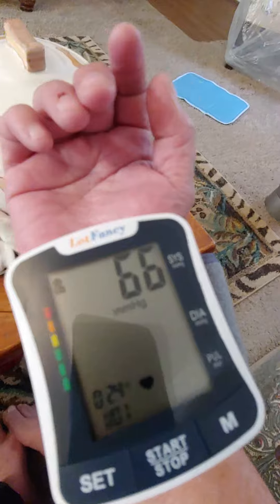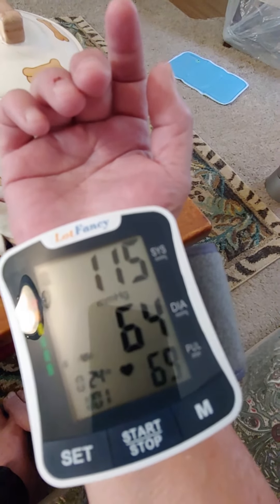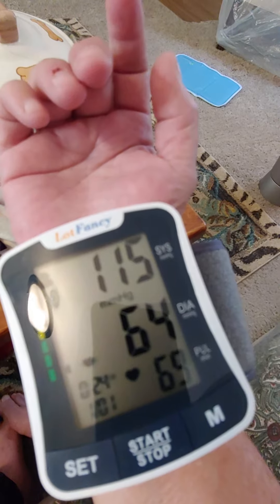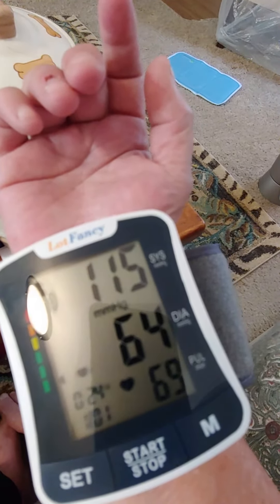Wow, that's low. And 115 mm of mercury. Diastolic pressure, 64 mm of mercury. Heart rate, 69 beats per minute.